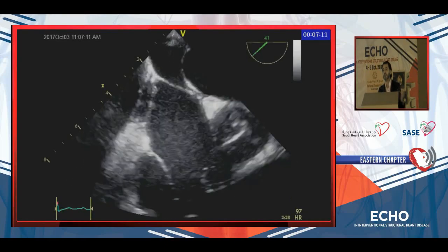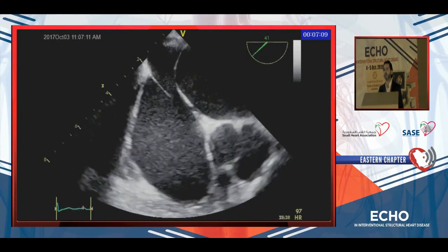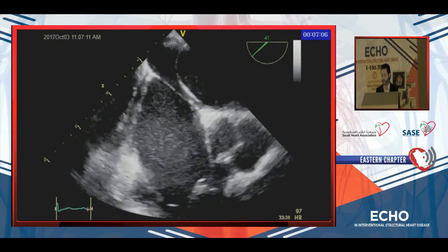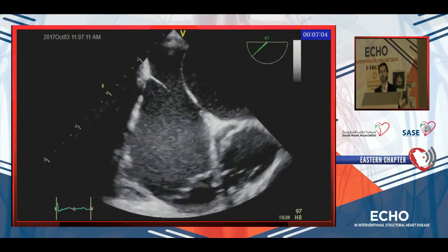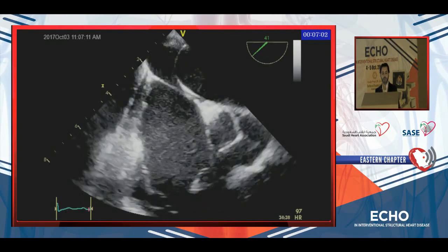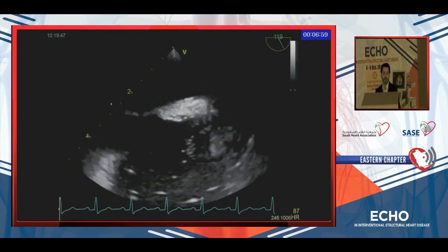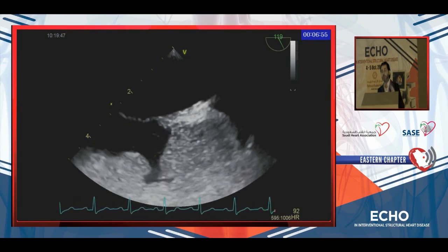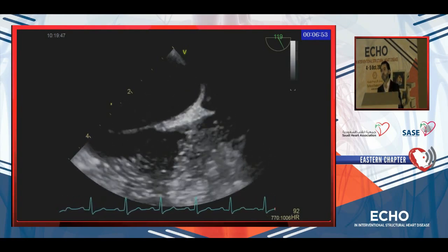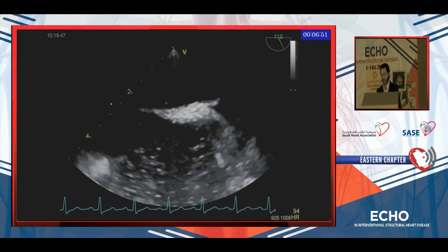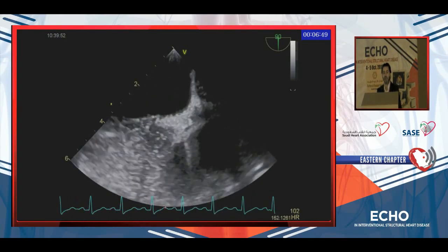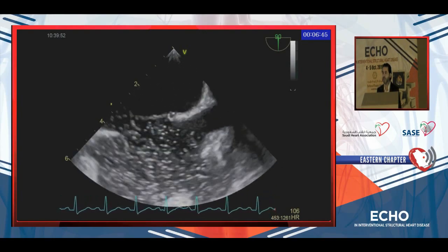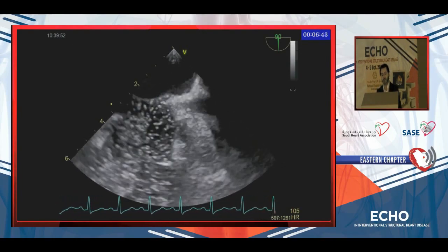Sometimes, if you have a Eustachian valve and you are worried it will prevent the bubble from contacting the fossa ovalis, you need to do something different. As seen here, most of the IVC bubble-free blood will be in contact with the fossa ovalis. So what we did was inject the bubble via the lower limb — and here it is significantly positive for a PFO.